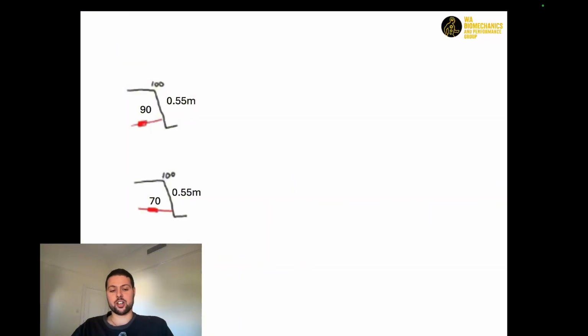So he essentially set up these parameters, and there are two examples of a person set up within a knee extensor isometric inline pull test. Those scores of 100 on both of those, the top one and the bottom one, represent the torque created at the knee joint.